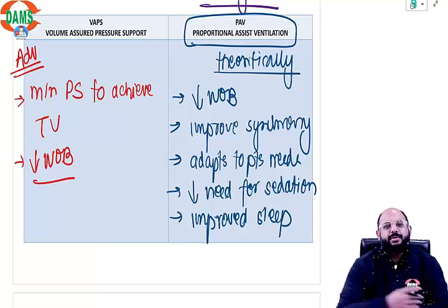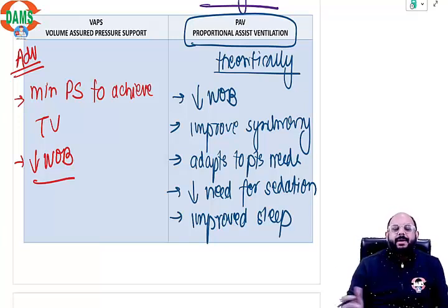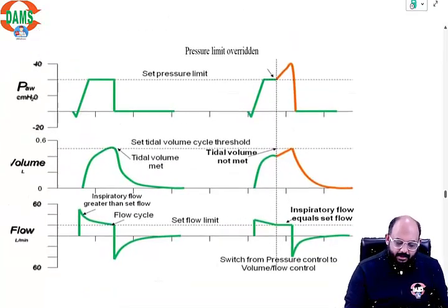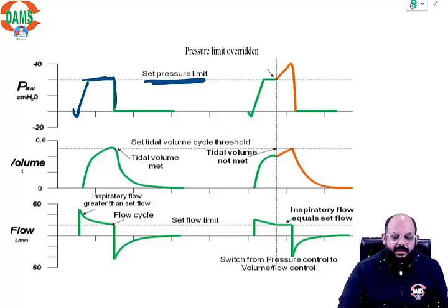They both can change the intra-breath cycle. They can change the characteristic of the breath intra-breath. See, this is what it means. This is the set pressure. This is the inspiratory trigger by the patient, and this is a pressure breath that is given.